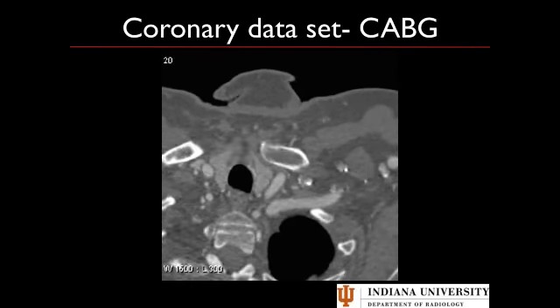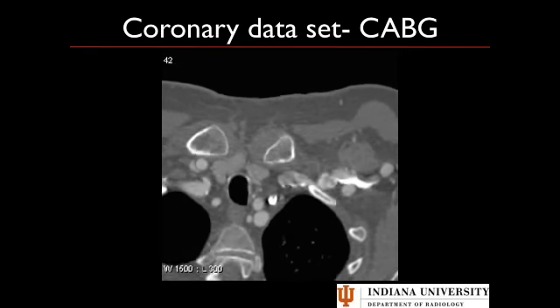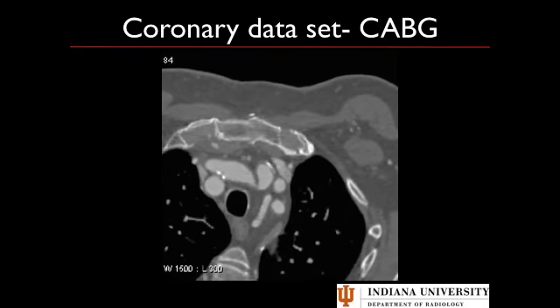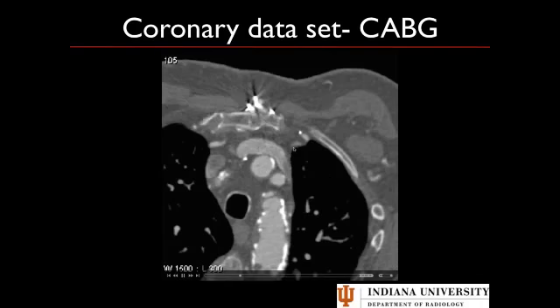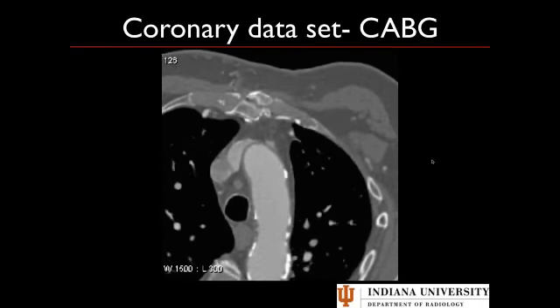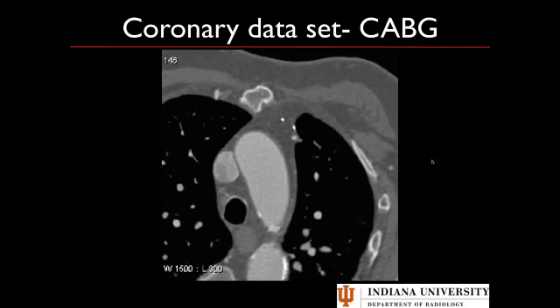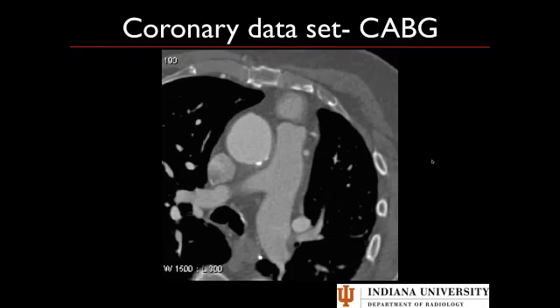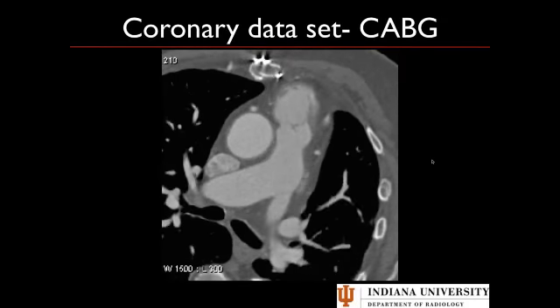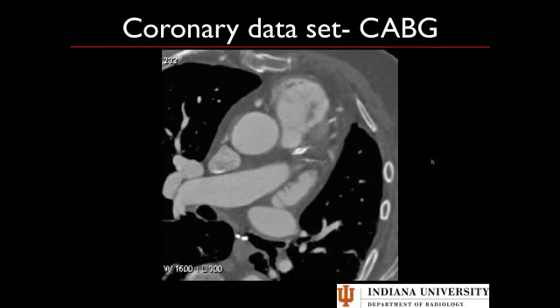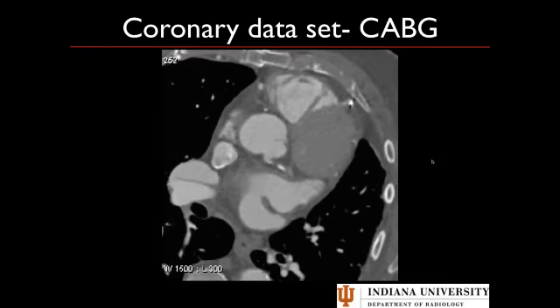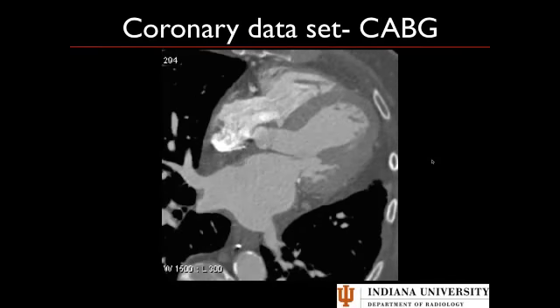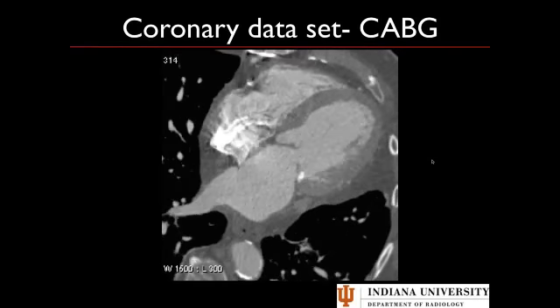Here's a CABG dataset. You'll notice we're starting higher. On a CABG study, especially if you don't know whether the patient has an internal mammary bypass graft, you want to start relatively high so you can see the origin of the left internal mammary artery from the subclavian. I've seen cases where there is stenosis in the proximal left internal mammary artery at the origin from the left subclavian, so you want to follow it all the way down. In general, we always start above the level of the origin of the LIMA and scan all the way down through the heart.